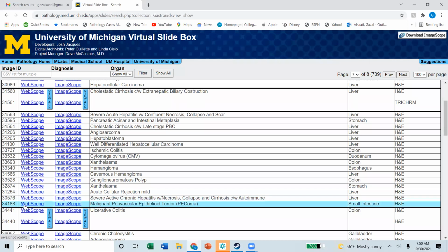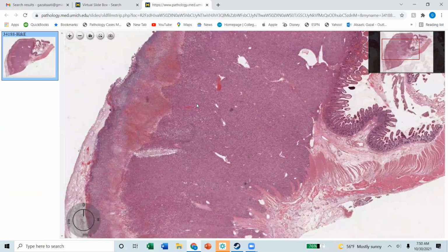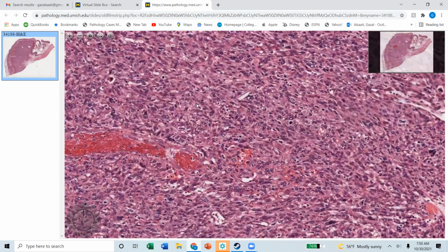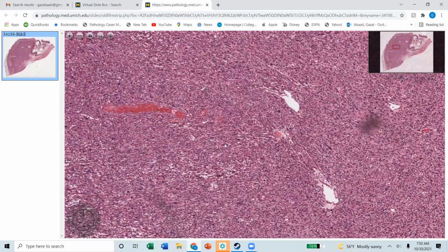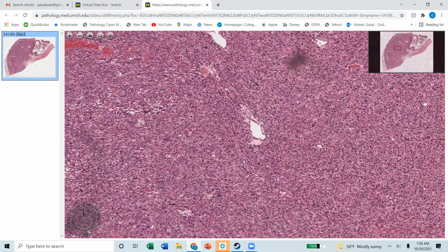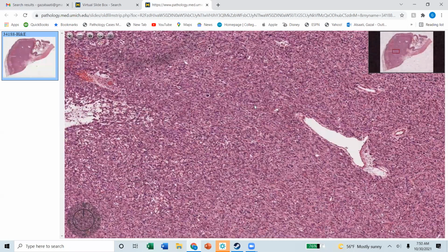Severe active chronic malignant perivascular epithelioid cell tumor, PEComa. All right, my soft tissue colleagues. Here, let's see. The staghorn vessels all over. Can you guys remind me of the stains? I have not done that in a long time.